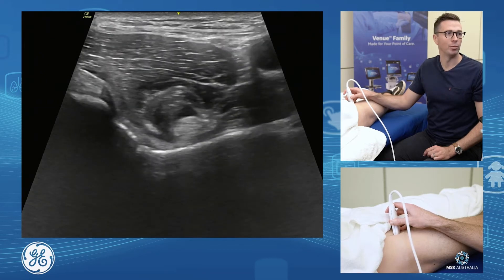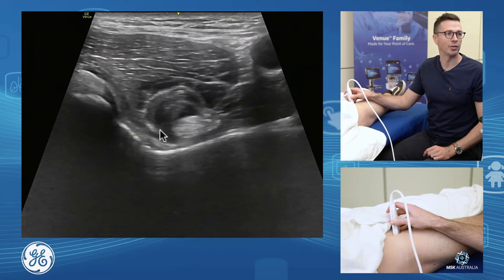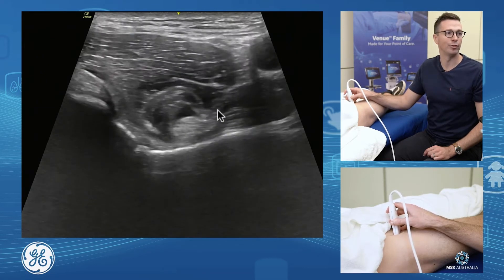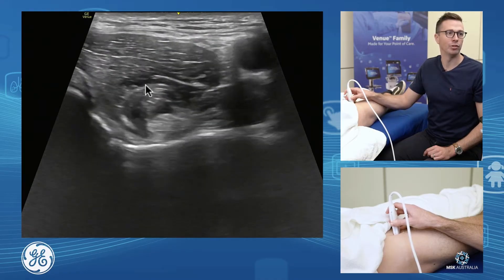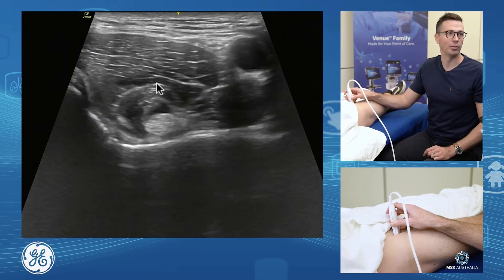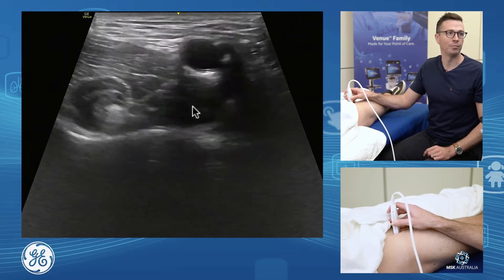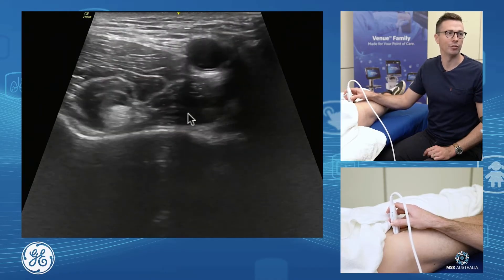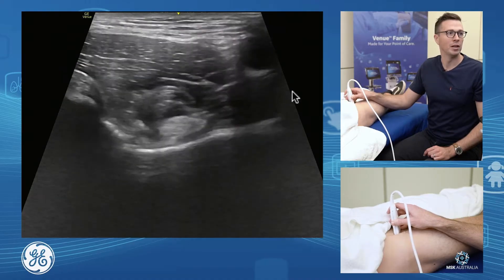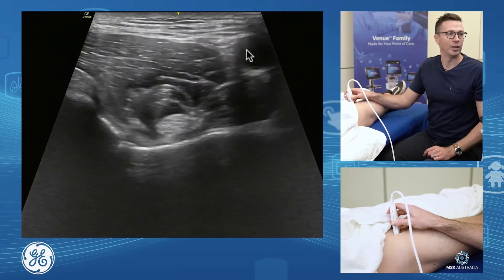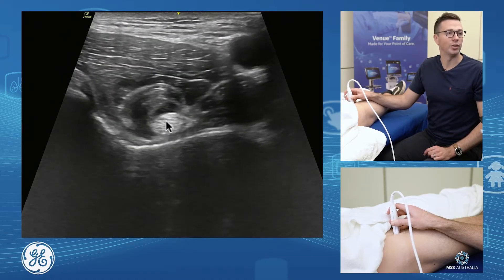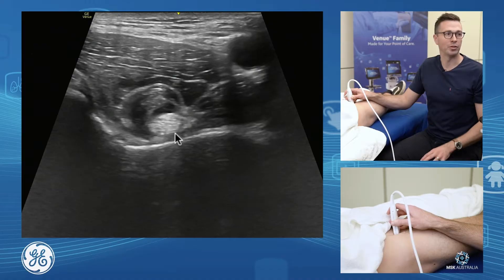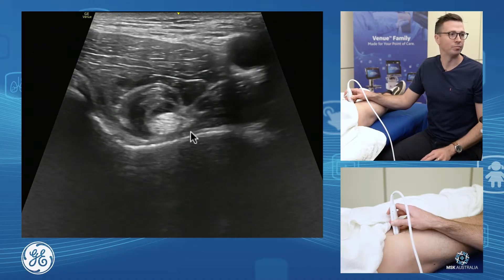We have the medial fibres of our iliacus, our lateral fibres of our iliacus, residual fibres of our psoas, and the neurovascular bundle sitting medially. So we see our iliopsoas tendon sitting nicely on the iliopectineal eminence of the acetabulum.